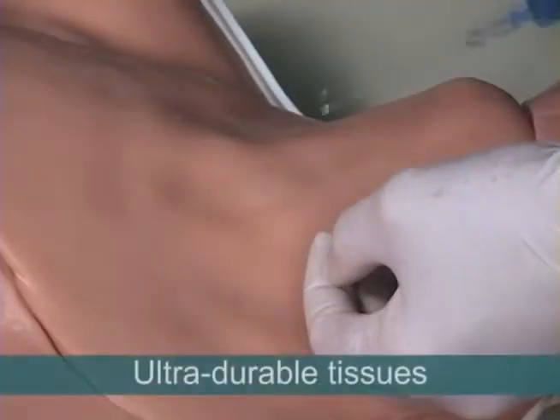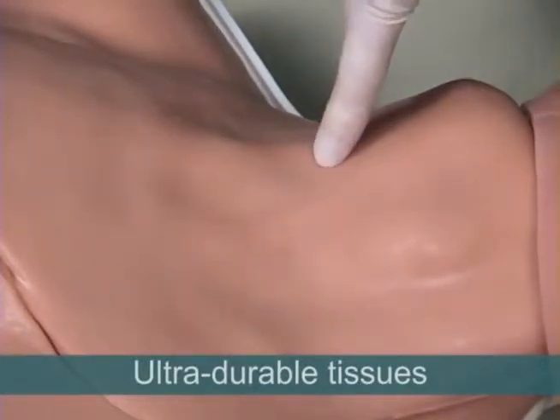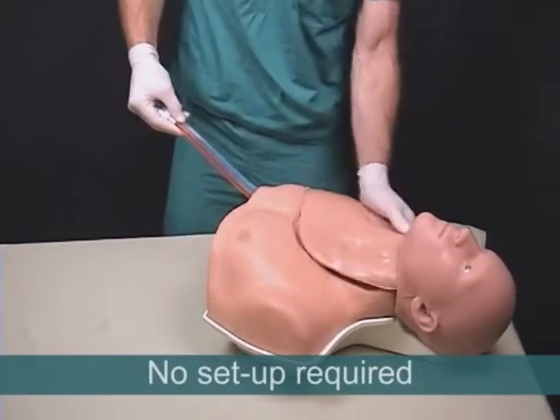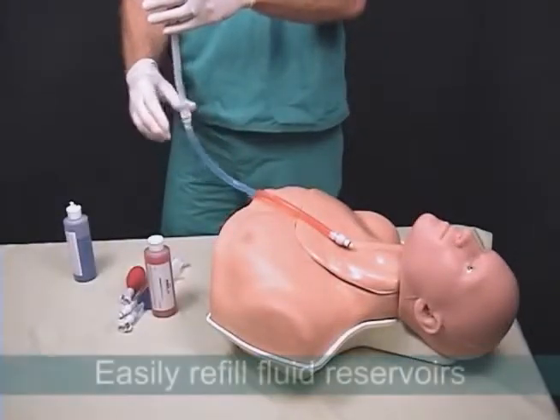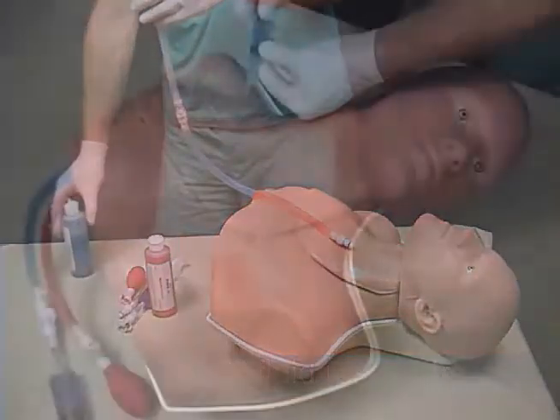The system's tissues are ultra-durable and self-sealing, capable of enduring hundreds of needle insertions and dozens of full catheterizations. The system requires no complicated setup — it is ready to use right out of the case and includes fluid reservoirs that can be easily refilled whenever necessary.